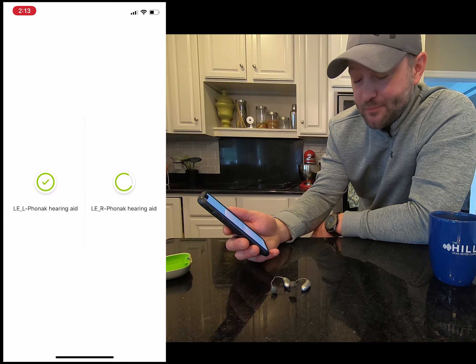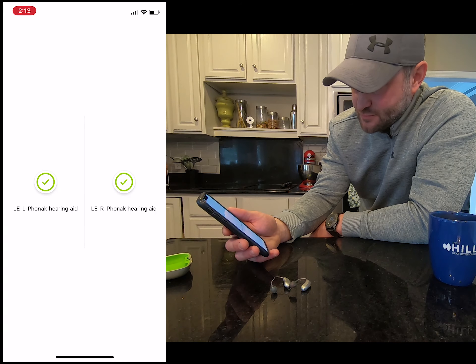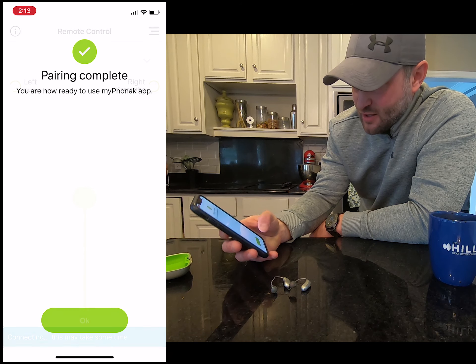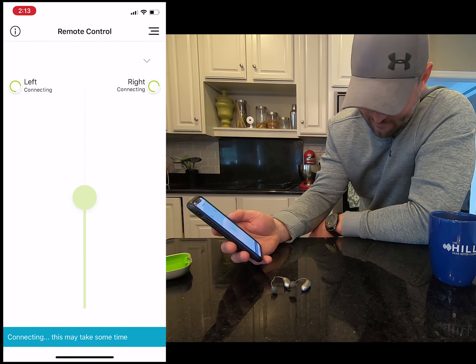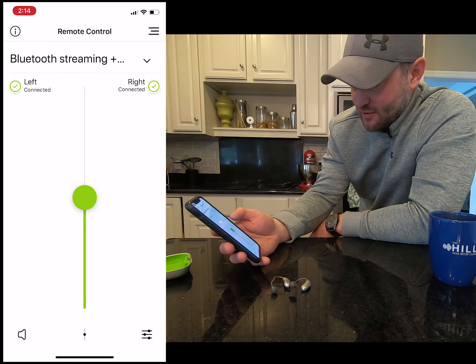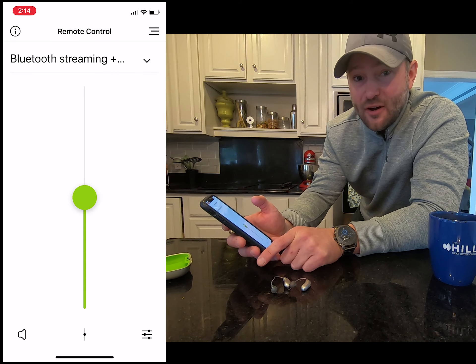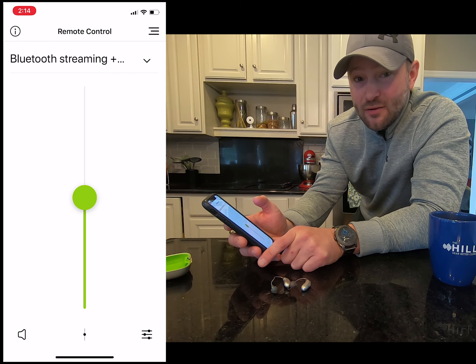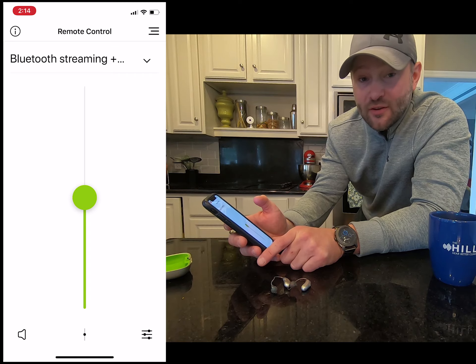The right one we have to pair again — it seems silly, but if you want audio and remote control ability this is what we have to do. Now it's complete and ready to use the app. It'll actually let us change the volume and things like that. That's all there is to it. Again, I'm Dr. Ryan Hill, audiologist out of Cincinnati, Ohio with the Hill Hear Better Clinic — thank you.